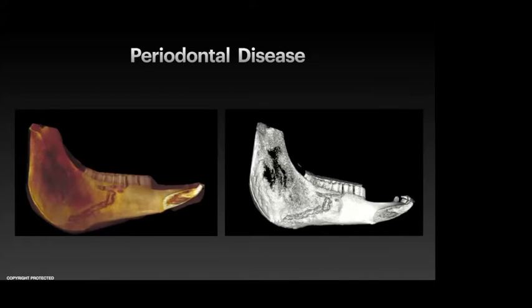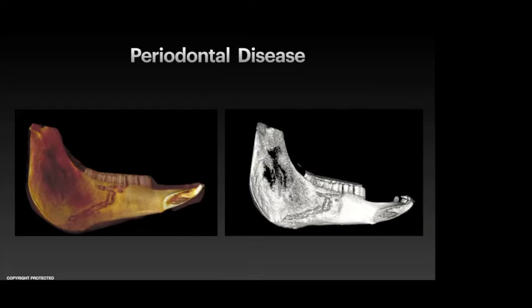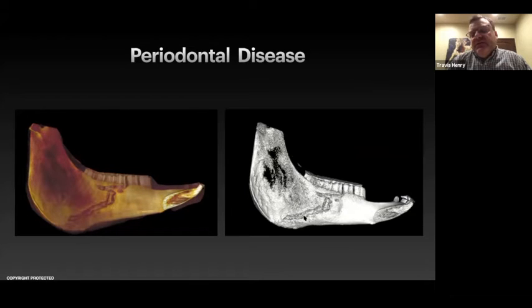So on this case. Yes. Yeah, so this was interesting. Ask the question again. You cut out for a second, Sabrina. How do you differentiate that this is a fistula that's septic or not a mandibular fracture? Yeah, because it was on the medial side of the mandible, this could have started out with trauma, of course, but this horse had reportedly had periodontal disease for a long time that was left untreated from previous oral exams. So we assumed that this probably came from a deep periodontal infection more than from a fracture or trauma.